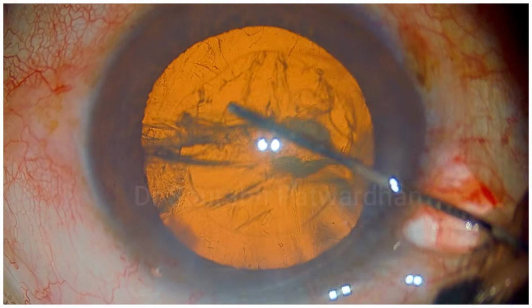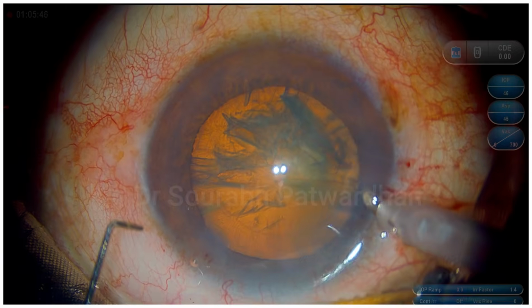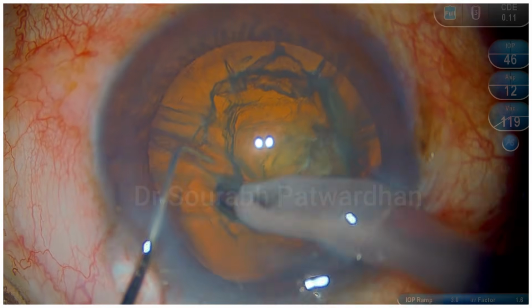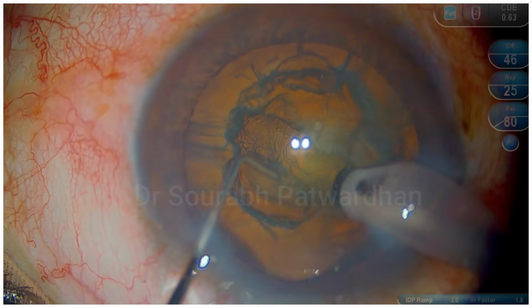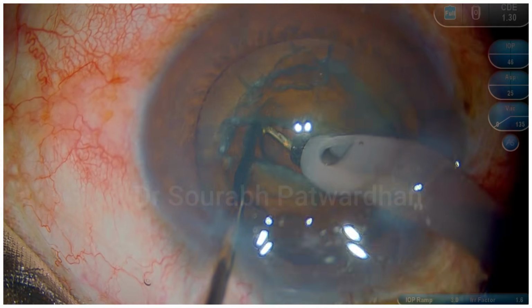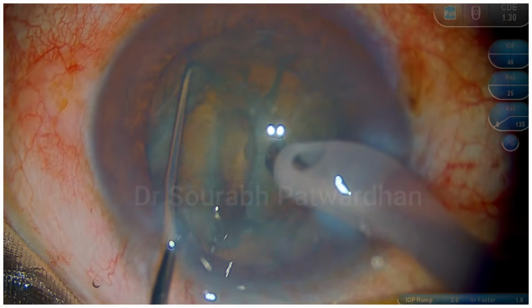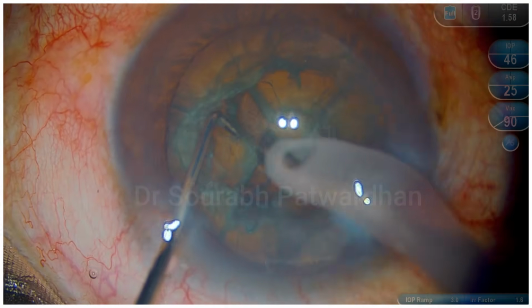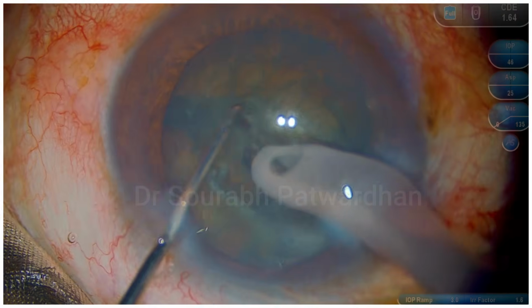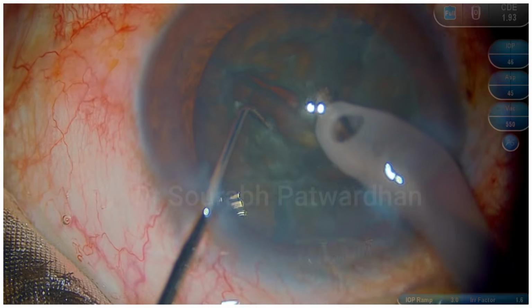Capsulorhexis is done using the forceps, a good hydrodissection, you can see the wave there, and rotation is achieved, followed by phacoemulsification. Now, because this was a soft grade of cataract, I generally use the trench and divide technique. So, I have done the first trench here, divided into two heminuclei, then each heminucleus is further divided using the trench divide method. All going well there, and I could see no problem.